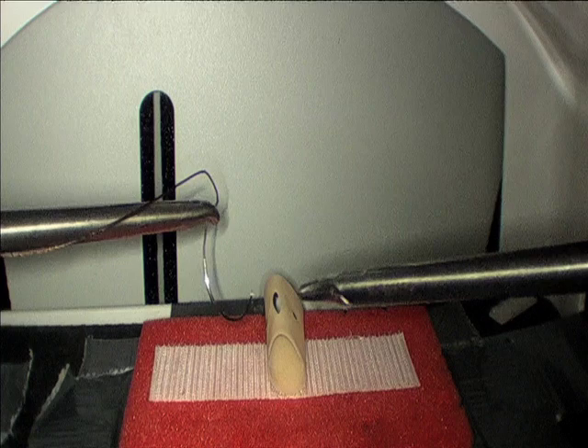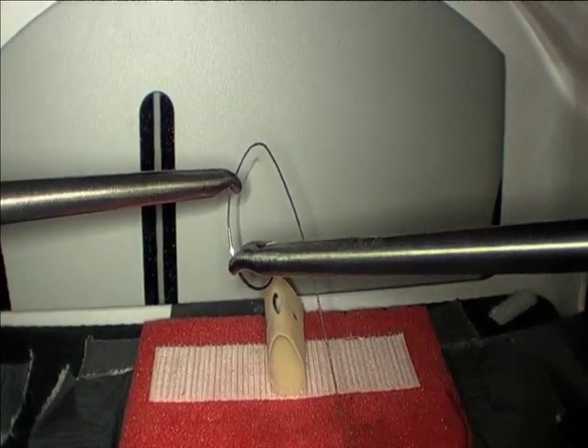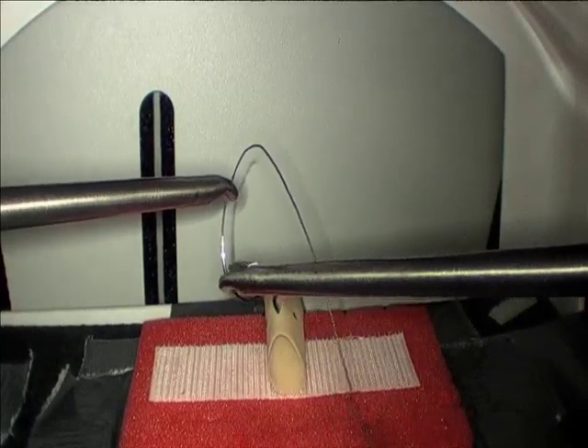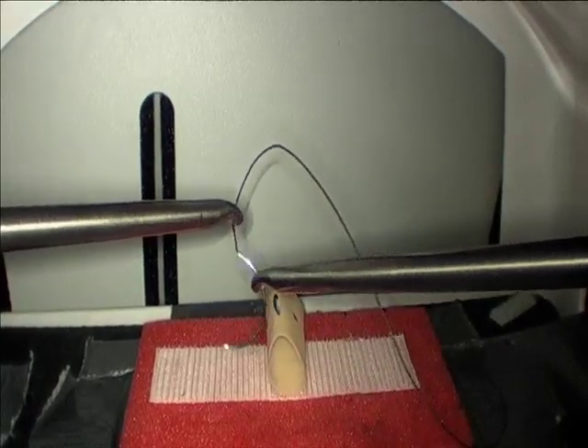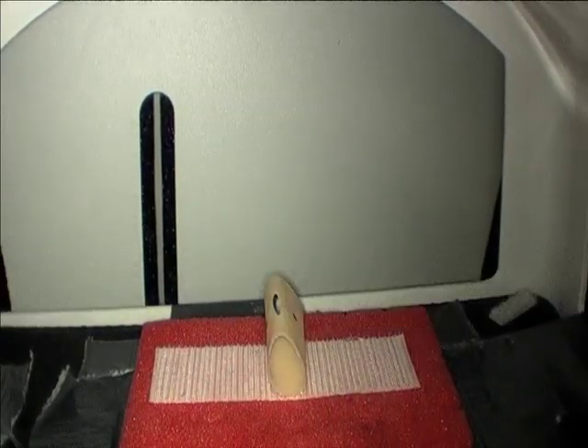Load the suture by grasping it with a needle driver approximately one centimeter from the needle. Load the needle by grasping it with your needle driver and using the suture to spin the needle into position. This is a very quick and effective way of loading the needle.